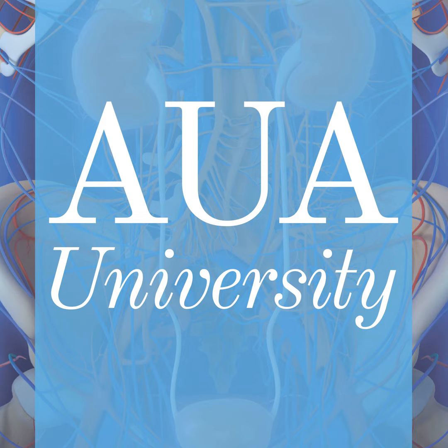So the patient responded quite well to this combination therapy. His PSA dropped to 1.04, which is not a very good prognostic sign, but at least it's a good decline. In the multiparametric MRI and the PSMA PET scan, there was a regression, but still significant avid activity.